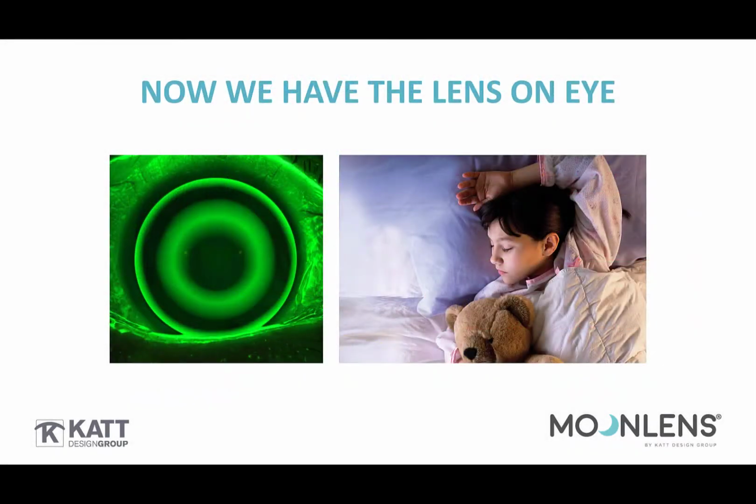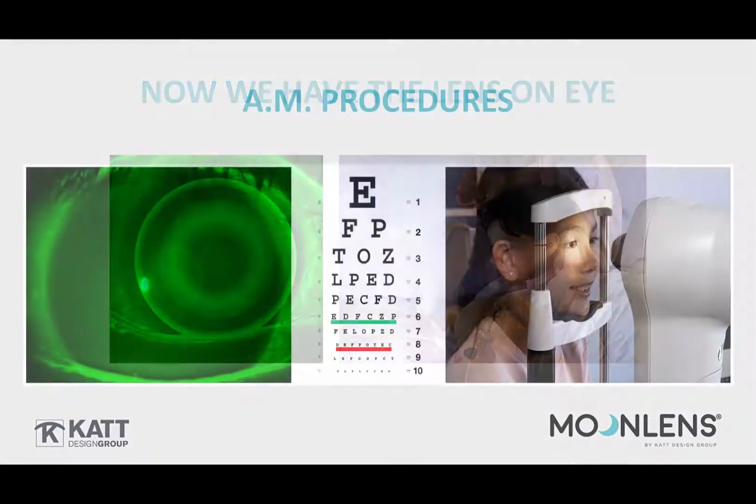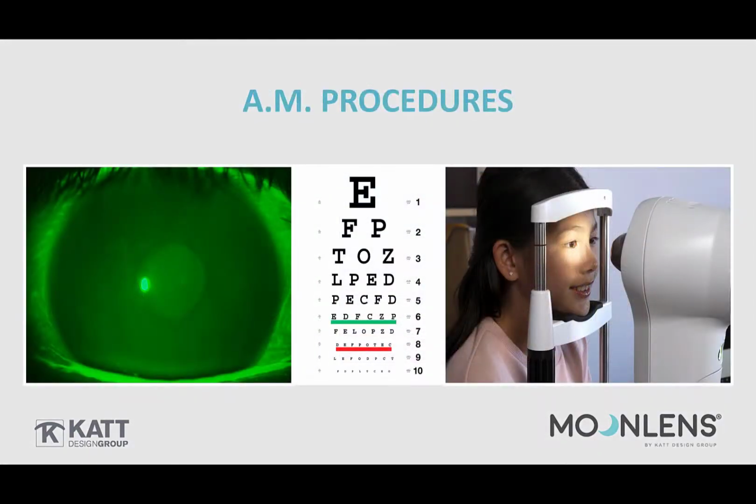After your custom lenses arrive from your MoonLens distributor, evaluate the fit, train the patient, and schedule the overnight wear visit. When the patient presents after one night of wear in their MoonLenses, perform a thorough slit lamp exam and check the acuity. You may want to show the patient what the uncorrected acuity was prior to treatment and how that compares to the visual improvement after just one night of wear. Then it's time for the post-fit topography capture.